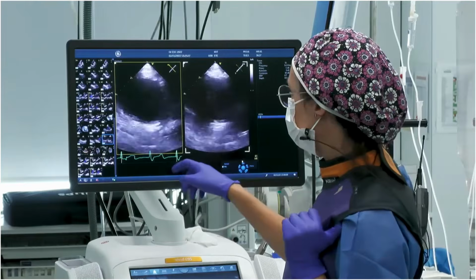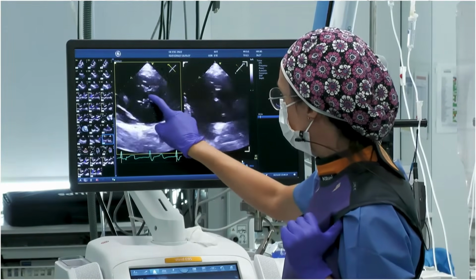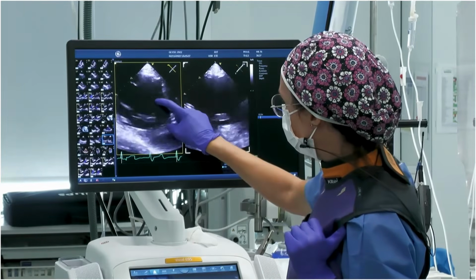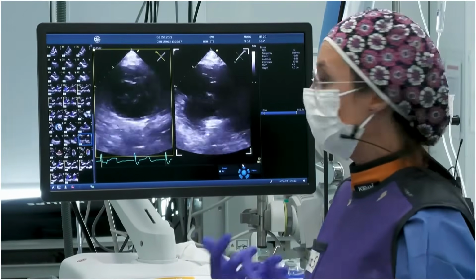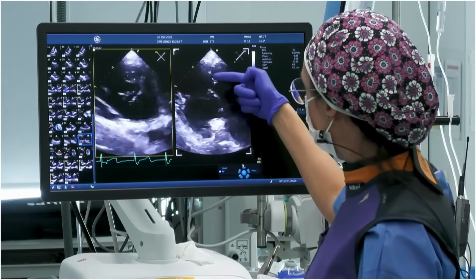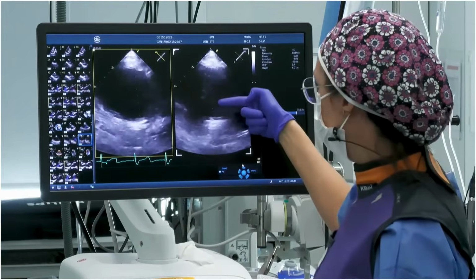One is in the transgastric short axis view. We can make measurements here. Here we can measure the gap between the septal and the posterior leaflet, and also here between the septal and the anterior leaflet. But to be sure that we are not overestimating this gap, we need to do the biplane, just to be sure that we are cutting just at the tip of the leaflets and not over the leaflets.